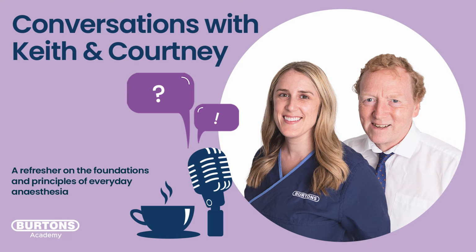Your CO2 will go from 45 to maybe 30, or 20. That's a true reflection of the cardiac output change, because of a change in the amount of blood flow into the lung in each stroke.